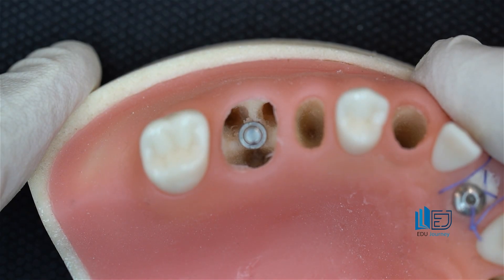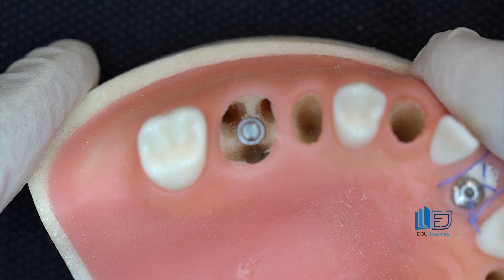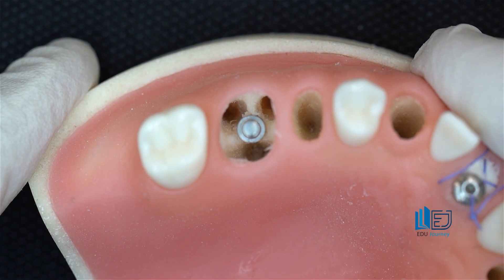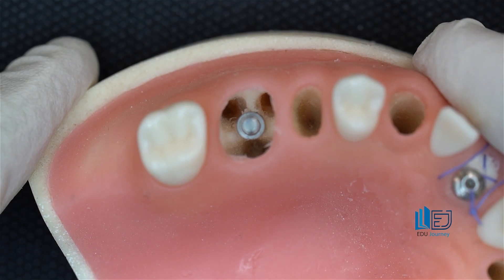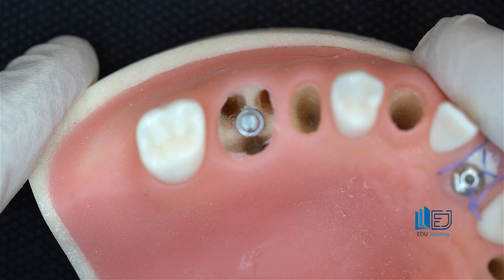Not all posterior teeth or molar teeth are candidates for fresh socket implantation. Being able to determine from the preoperative radiograph whether a posterior molar is suitable for fresh socket implantation is extremely important. Whether the roots of the molar teeth are divergent or convergent is key. If they are divergent, the bone in the furcation area is substantial and it's a good case for fresh socket. But if they are convergent, there isn't suitable bone in the furcation area — it's not a good case for fresh socket.